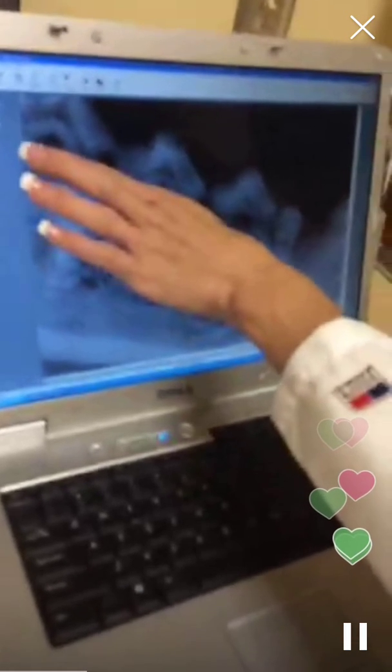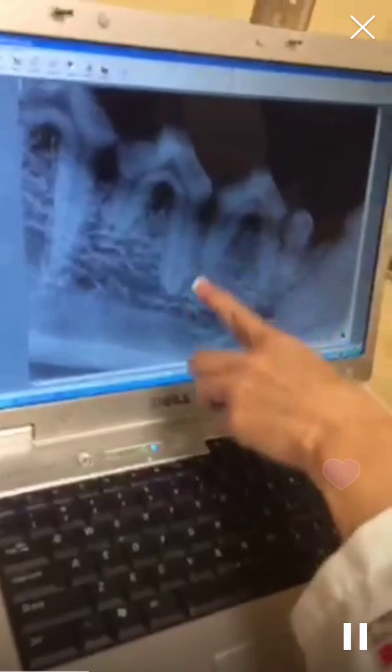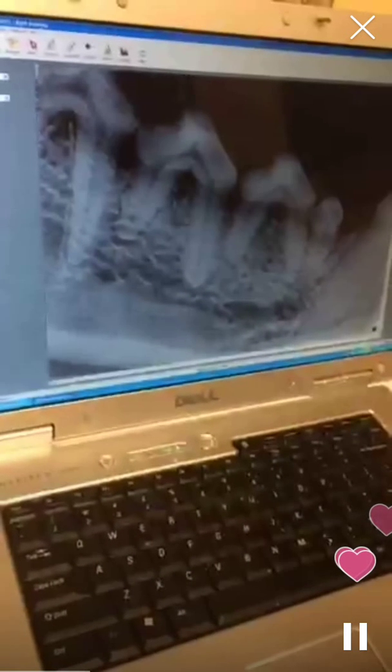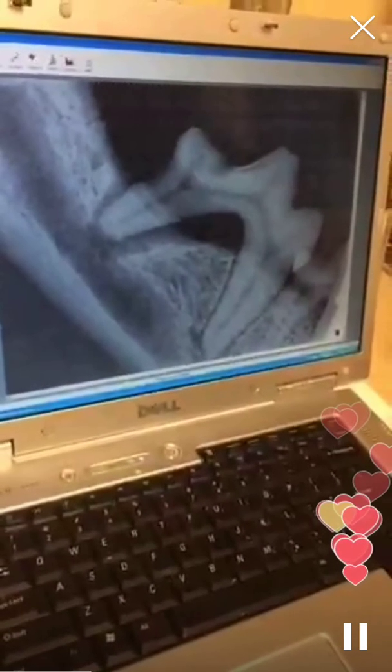And we have a little bit of horizontal bone loss. I'd like to see the bone of the mandible come up to here. But we have no effect on the periodontal ligament or the tooth roots. So these teeth actually stayed. No extraction there. Now, not the case here.